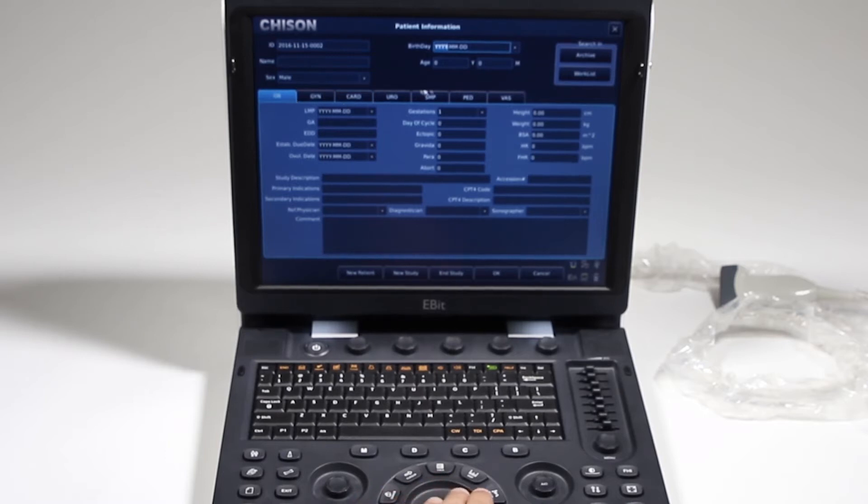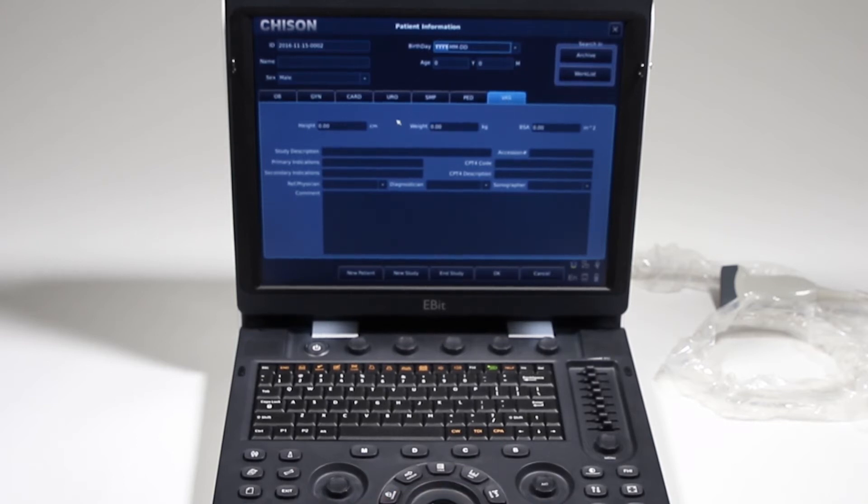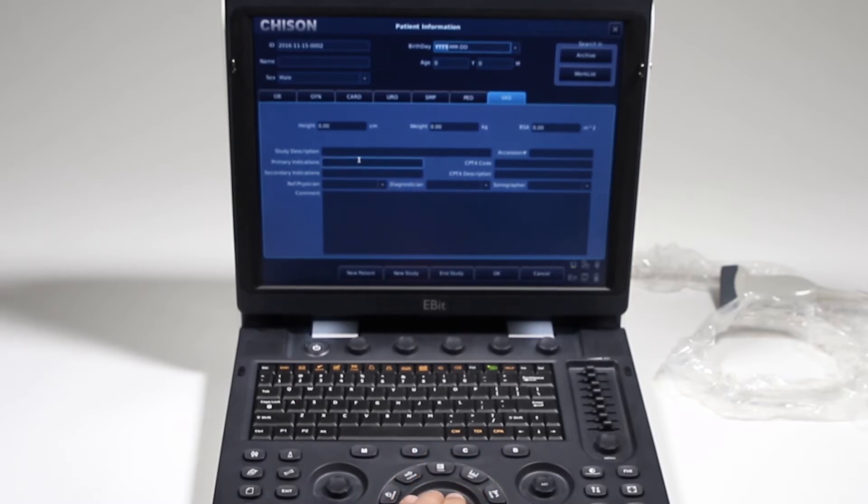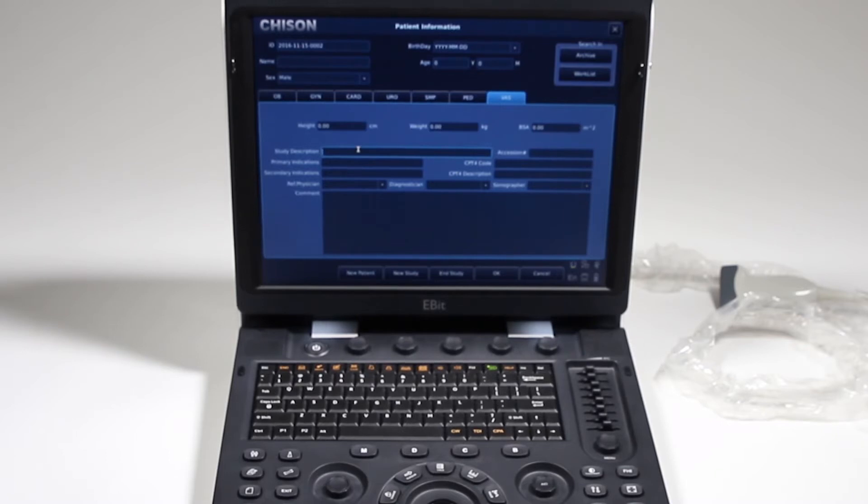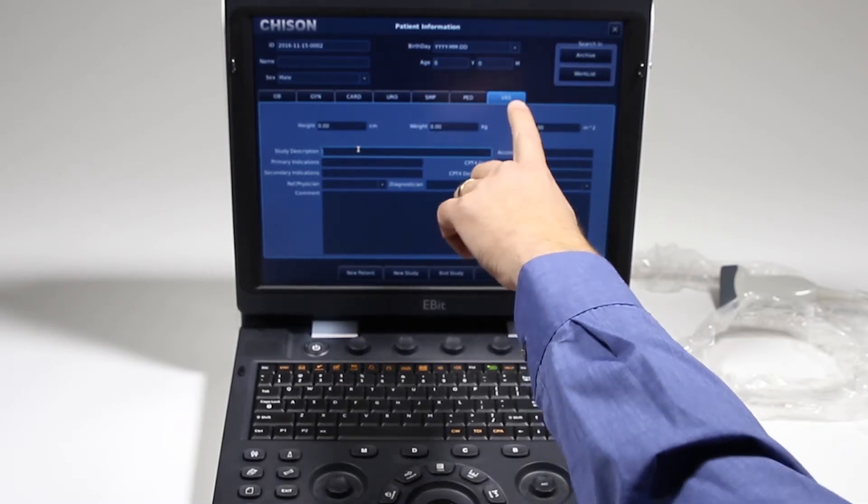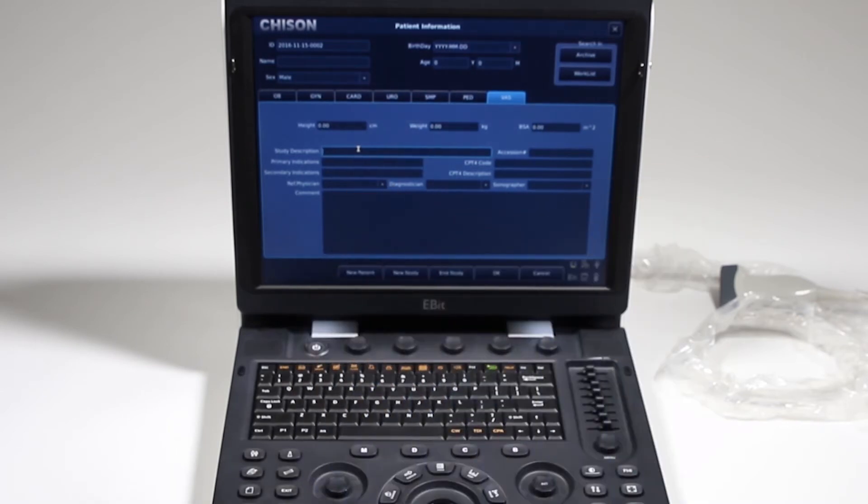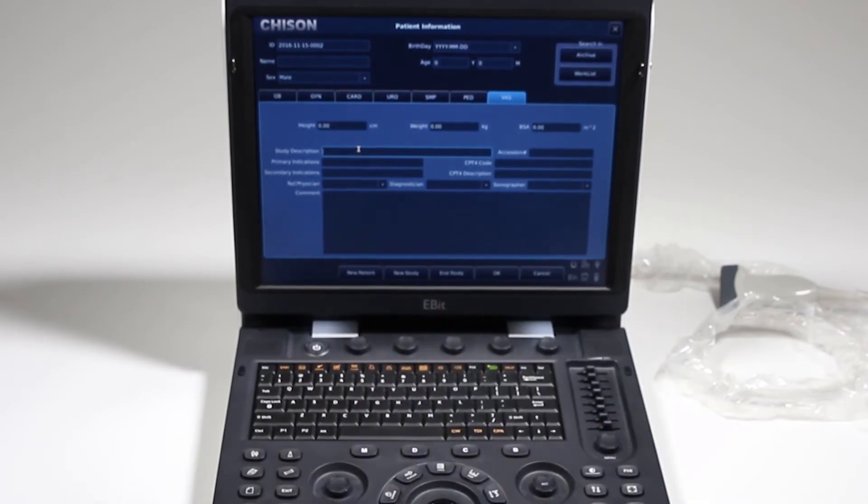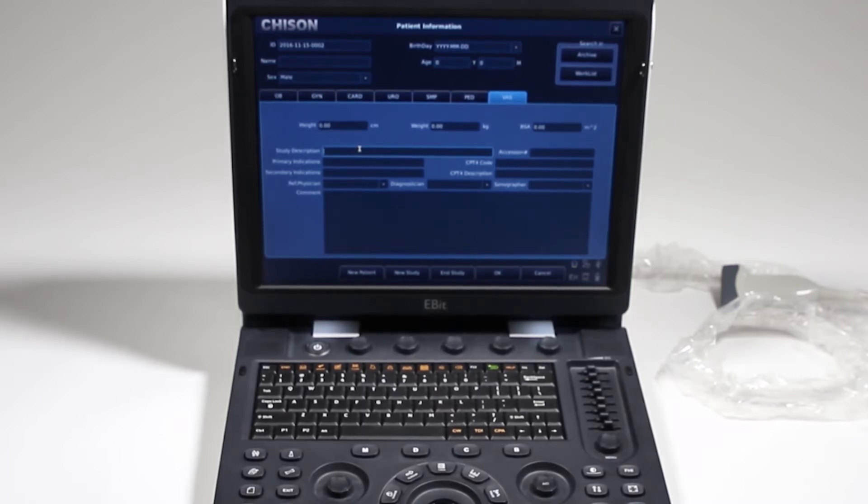Then you're going to select the study. Right now I'm doing vascular, and an important thing if you are sending this via DICOM: it's important to add a study description here because this is what will show up on the DICOM server as the study type. Just because you select it here and click vascular, it's not going to show up on the DICOM server as what type of study it is. If your radiologist requires that, that's where you'll want to enter that to make sure the study goes across.